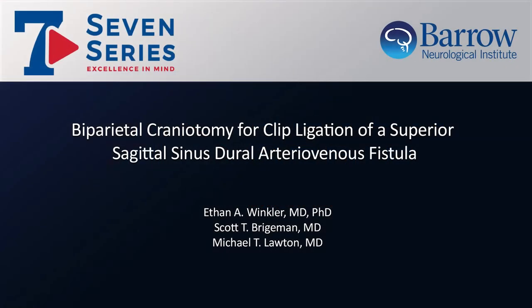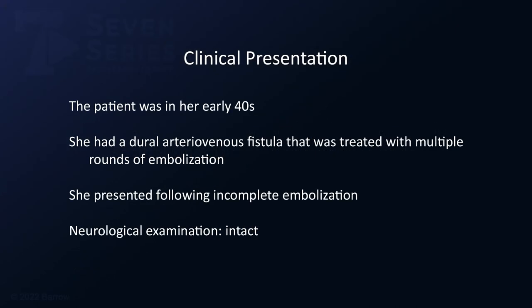This video will demonstrate a biparietal craniotomy for clip ligation of a superior sagittal sinus dural arteriovenous fistula. The patient was in her early 40s. Her dural arteriovenous fistula was treated with multiple rounds of embolization, which failed to obliterate the AV fistula completely. She was referred following this incomplete therapy.